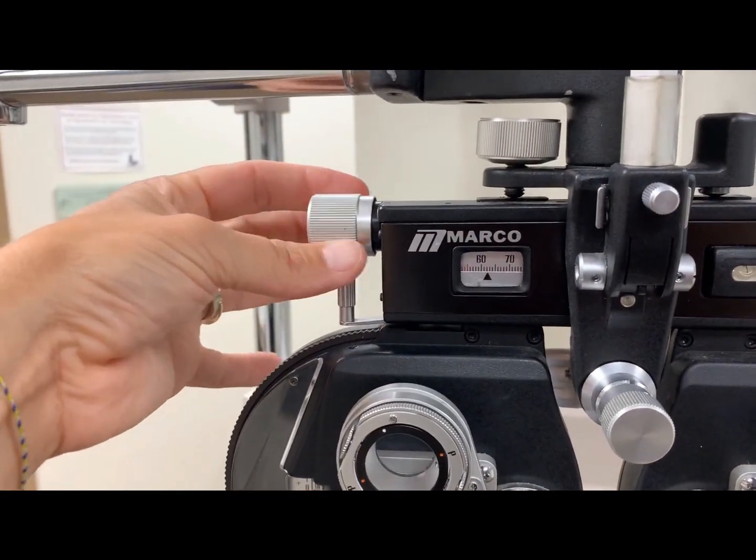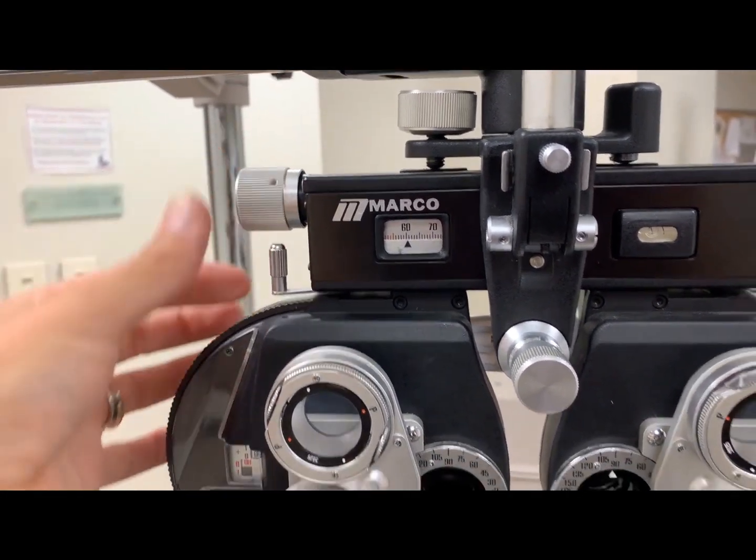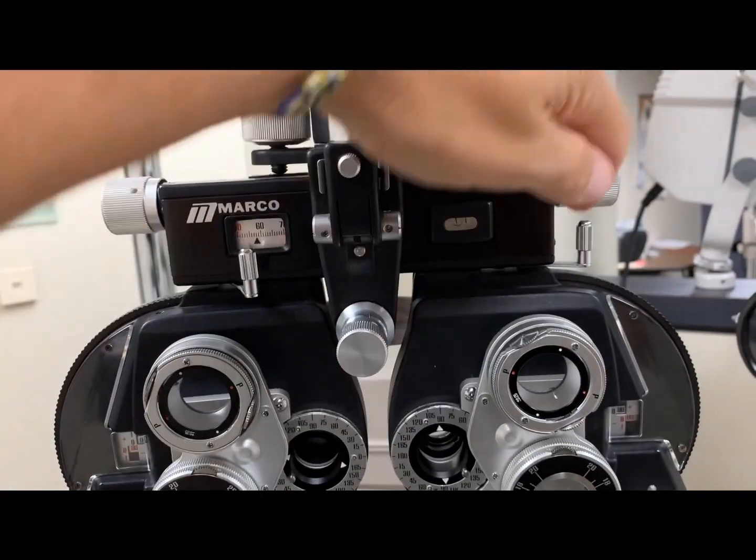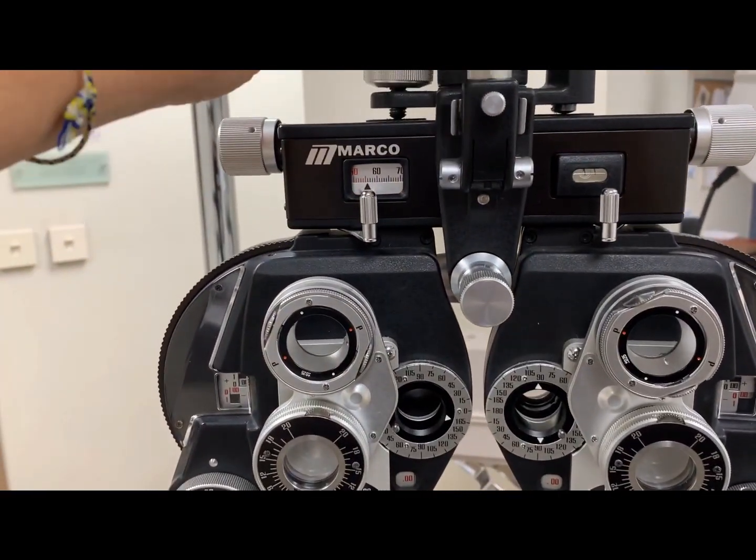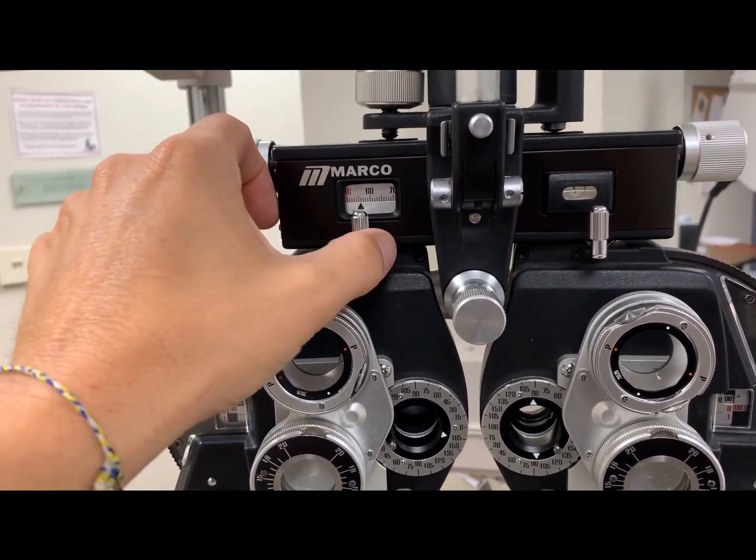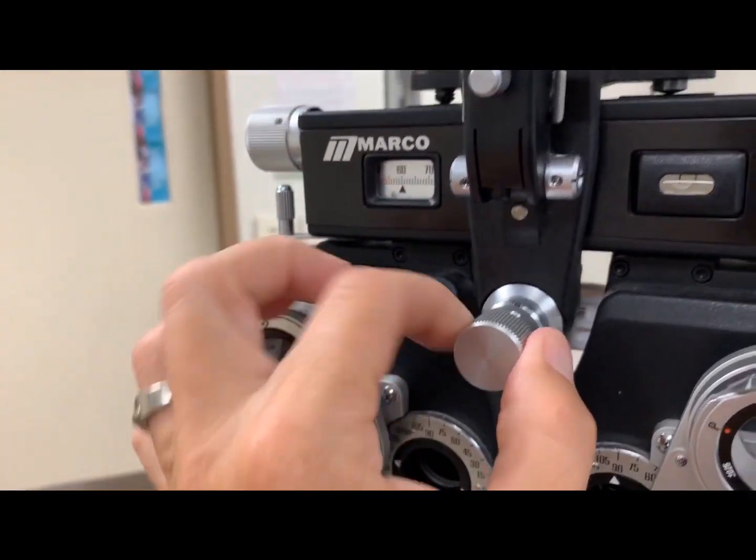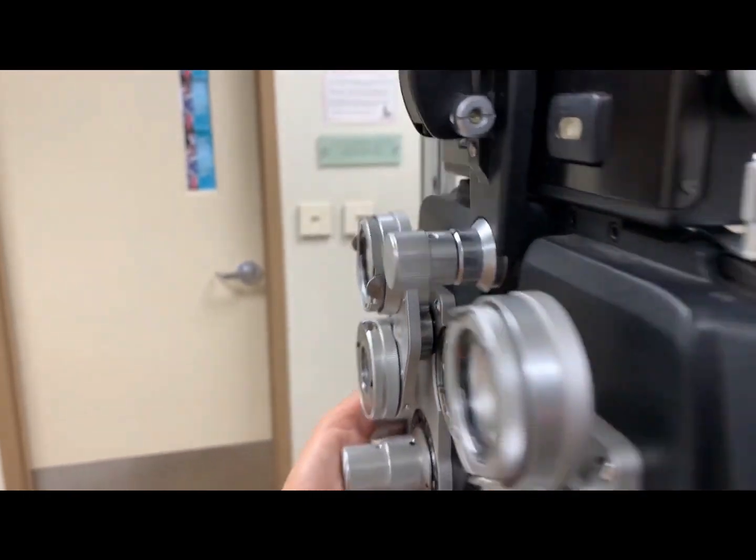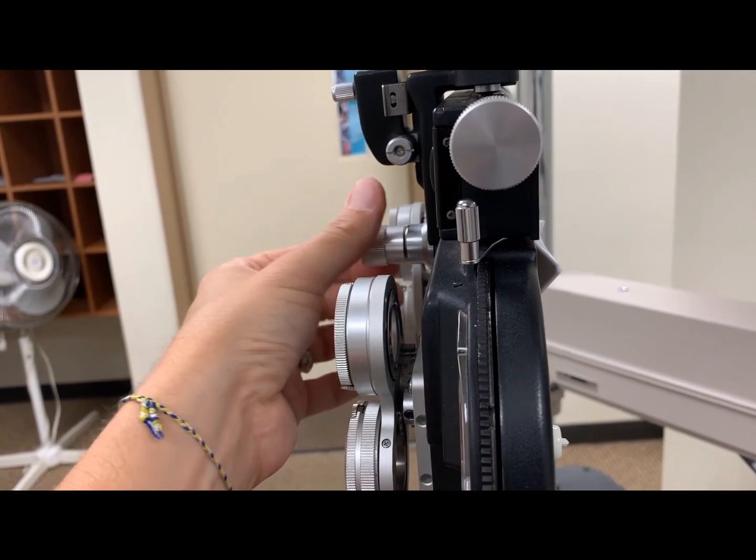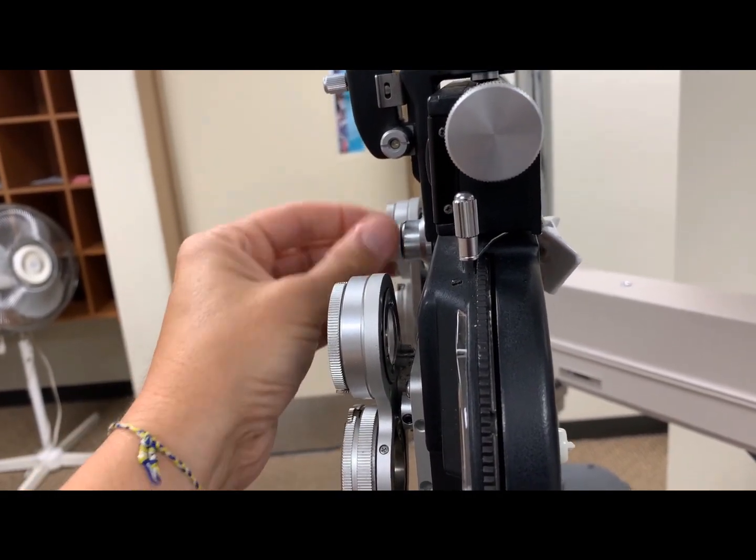This knob will change and adjust your PD. Typically, the PD will be set at distance to begin with, and then as you move to near, you will simply rotate these two levers inwards, which will then give you a near PD. The typical change is going to be a three millimeter adjustment from distance to near as you rotate these levers. This knob is going to simply change where the patient's forehead rest is, moving it out, pushing the patient further away, or bringing the patient closer.